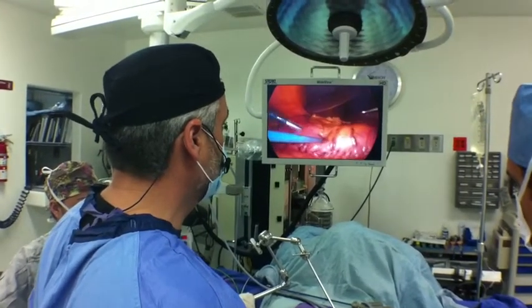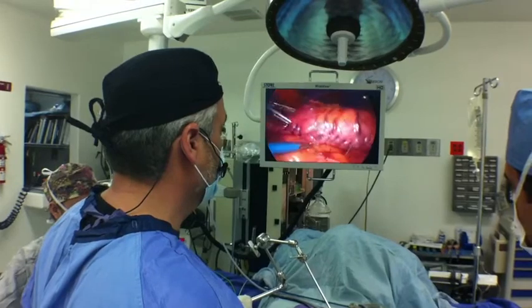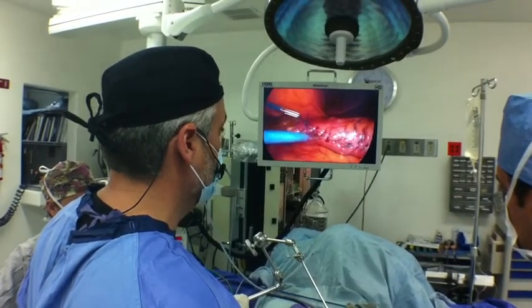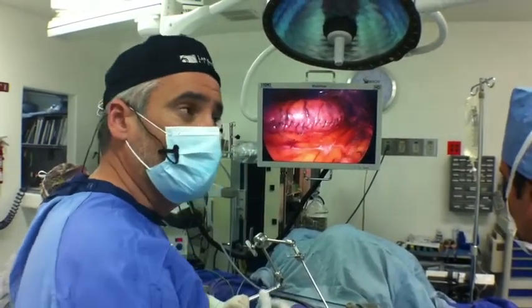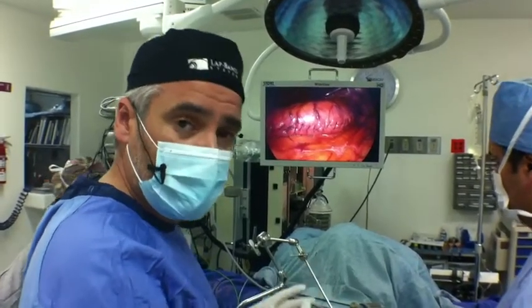The second containing line of stitches is very symmetrical, causing no ischemia whatsoever. This combination of stitches is what keeps this technique and keeps the patient complication-free.